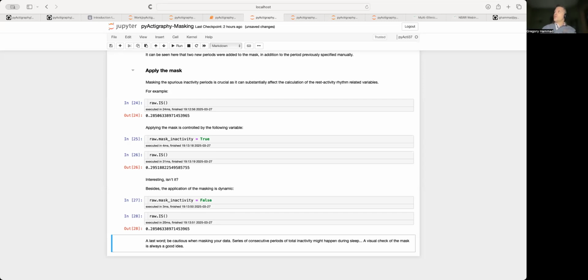It could be done. It's like the example that I showed for the Oura ring. I don't know for the Oura Ring, but for the Fitbit, for instance, it's not a research grade device. And this is always something that is put forward. I know it is true, but at some point when you can access a million users' data over a year, you see, the power of the number is also something that is worth considering.